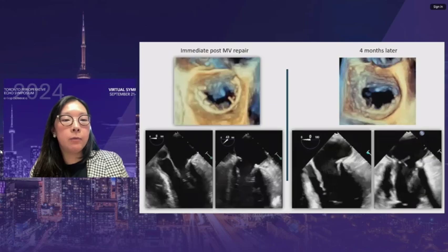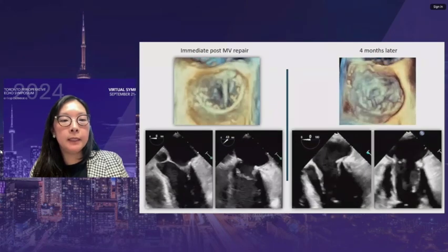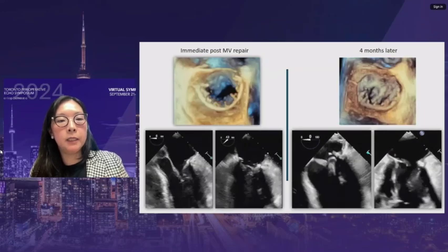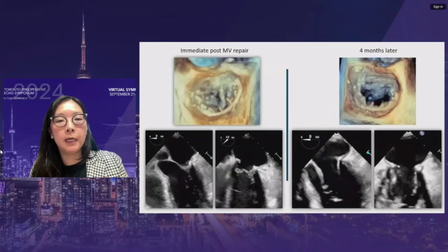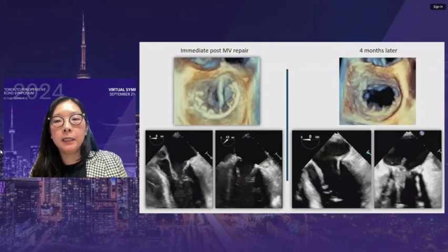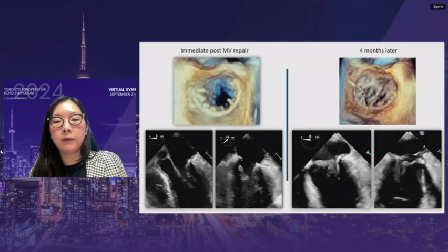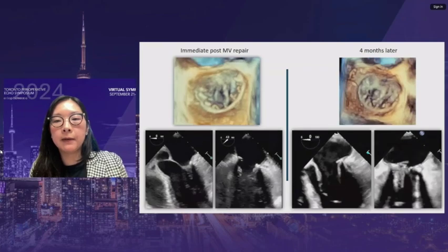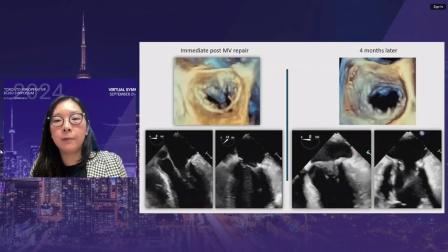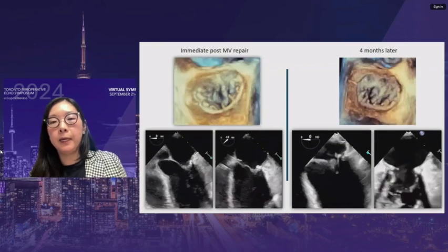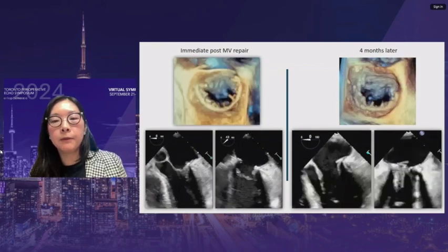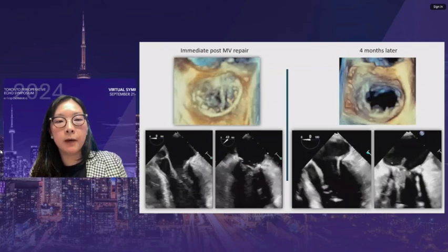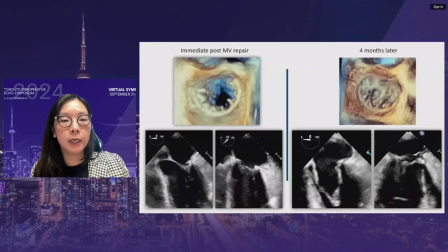A repaired valve case: the intraoperative post-repair image shows a nice repair with all sutures along the ring visible. The patient later returned with a stroke and was found to have vegetations on the mitral valve. At approximately 6-7 o'clock, small vegetations are visible growing from underneath the ring. This demonstrates how important it is to compare to post-operative images to accurately identify vegetations.